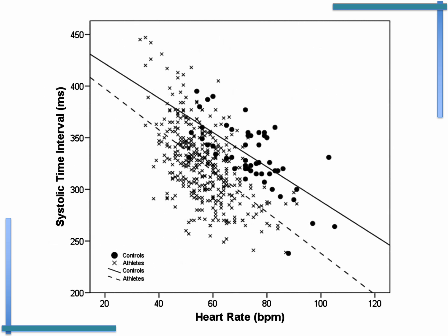And plotted here is the systolic time interval in milliseconds against heart rate, and this is for a group of different study subjects, and what we can see is that in general there's a fairly linear relationship between the systolic time interval and the heart rate. So how is this useful for the balloon pump?